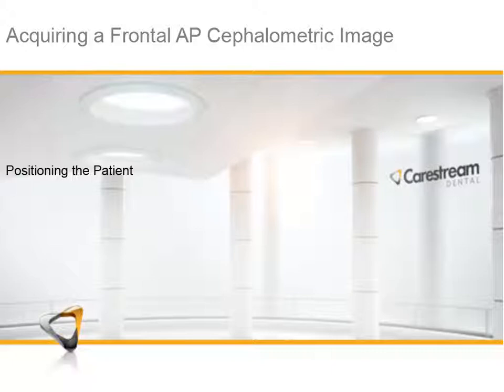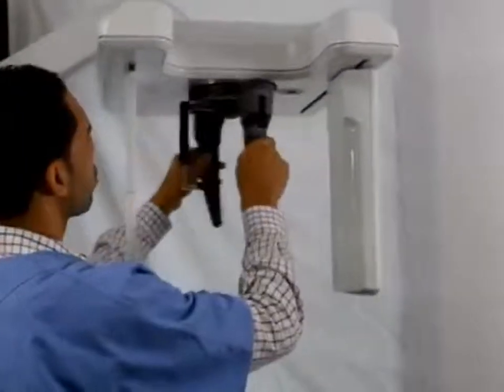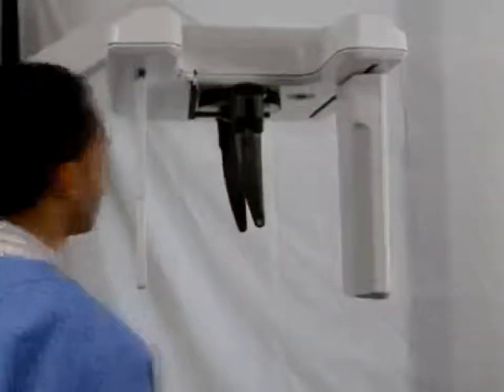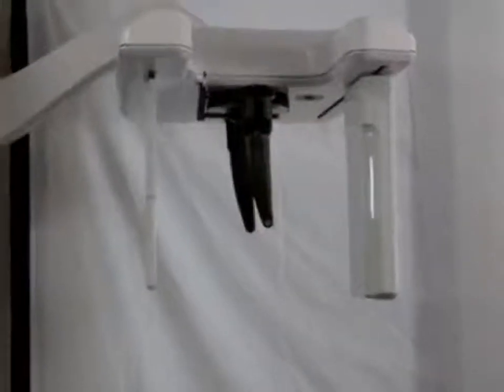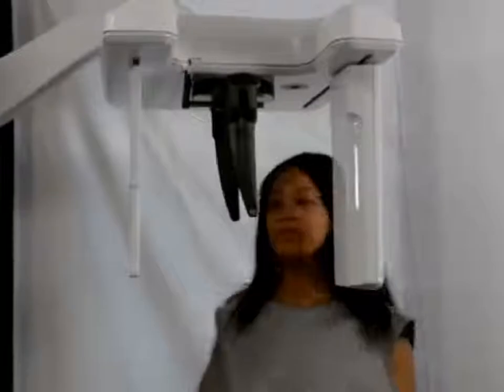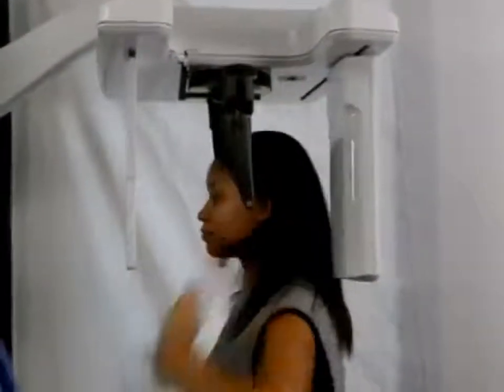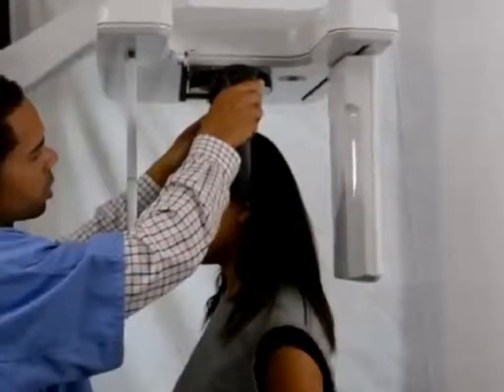Acquiring a Frontal Anterior to Posterior Cephalometric Image — Positioning the Patient: Position the head clamps by turning the clamps to the left and open the head clamps. Ask the patient to stand up straight in front of the cephalometric unit. For a frontal AP, the patient faces the generator; for a frontal PA, the patient faces the cephalometric sensor. After the machine is at the correct height, open the head clamps and instruct the patient to step into the machine. Slowly close the head clamps to stabilize the patient's head.